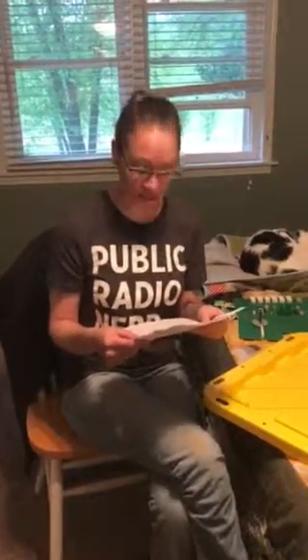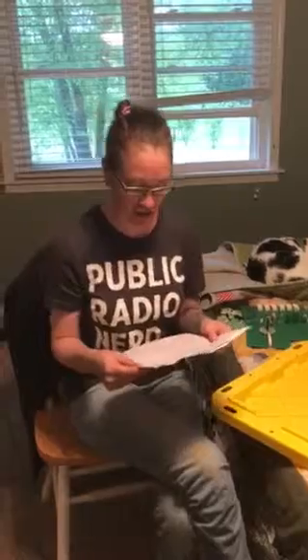Next, there's keyhole filling. This is similar to centric in that K space is filled linearly, but the center lines are only filled during particular parts of the sequence, which is very important when contrast is needed. There's single shot imaging, the fastest scan time possible, where all the lines are filled during one repetition. So all the data is collected from a single echo train.